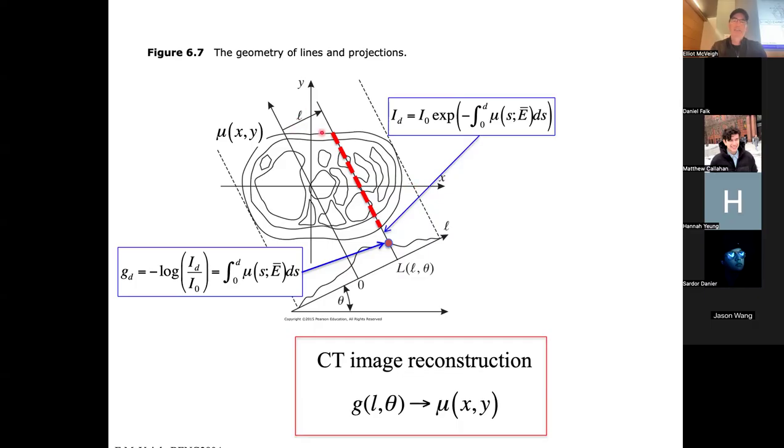And this would be the patient's chest, their back, their left arm's over here, their right arm is over here, in traditional sort of orientation. The image that we're going to create is an image of the linear attenuation coefficient, and that is the relative ability of X-rays to be absorbed by that tissue. Okay, that's the image that we're going to create.